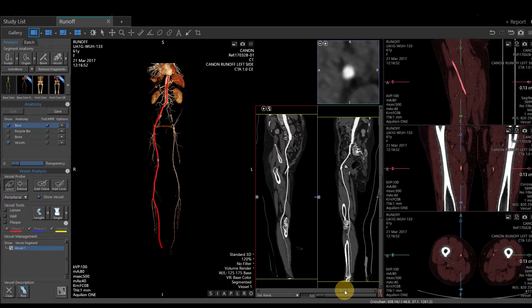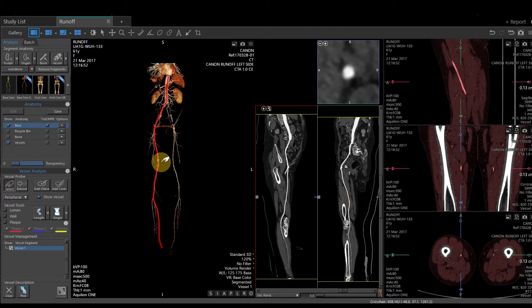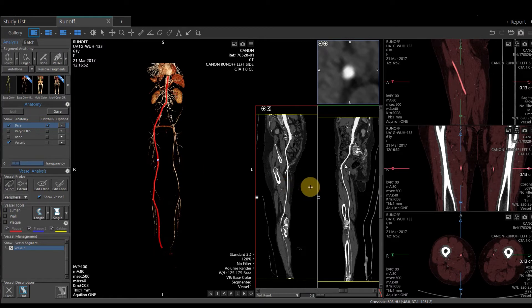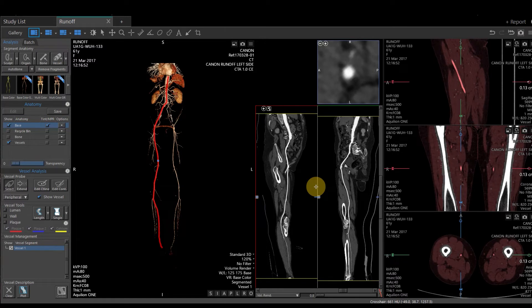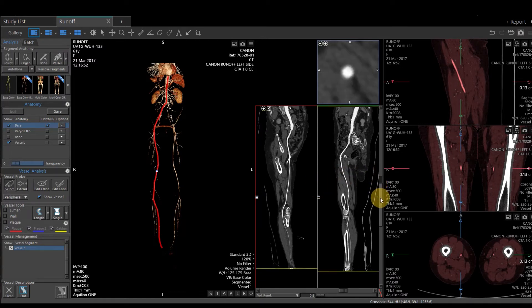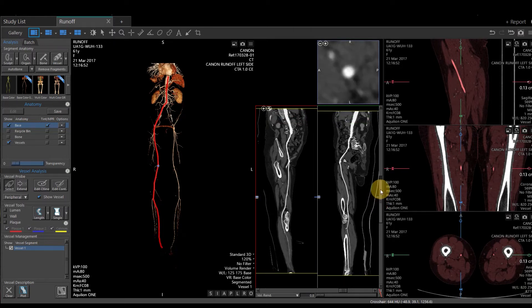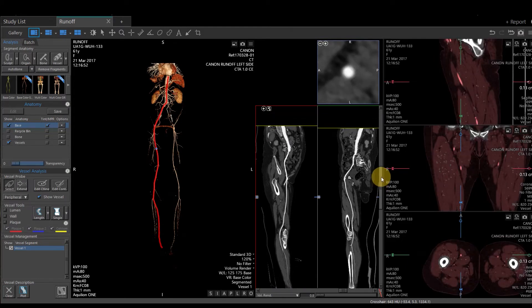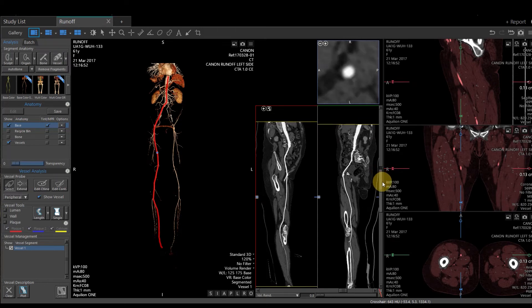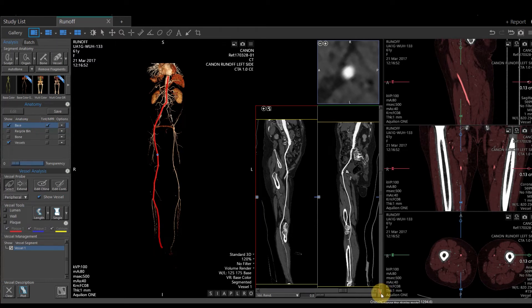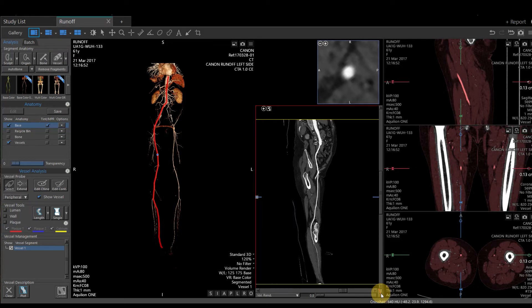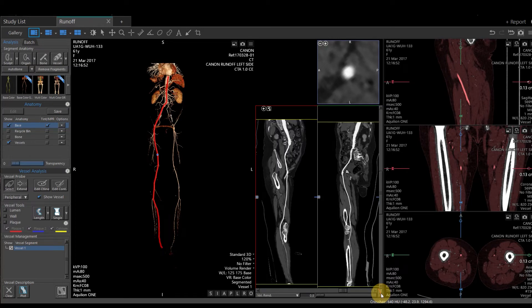Directly above the curved planar format, you have a transaxial slice. The transaxial slice corresponds to where this little blue hash in the center of the curved planar format intersects. You can also see this little blue dot on the 3D image. That is also showing us where we're located. You can scroll your mouse wheel to go up and down, or you have a slide bar directly to the right of that curved planar viewport, and we can go up and down in a transaxial view. There's a couple of different view options. If you do not like the split vessel view, there's a little red line down at the bottom right of the curved planar viewport. You can toggle through a single view. You can have a straightened out vessel view with a histogram directly next to it, and then you're back to your split vessel view.